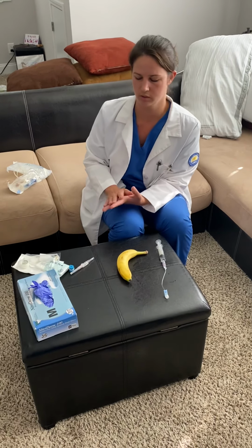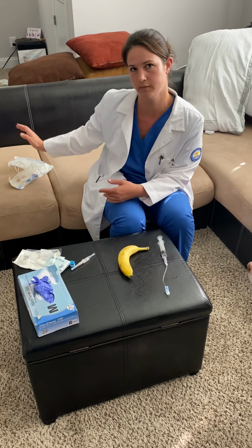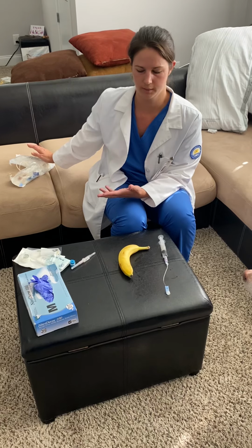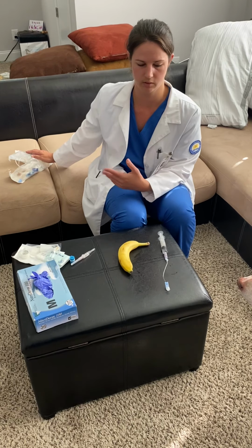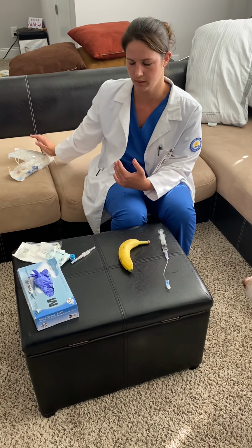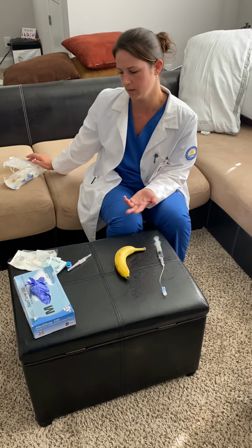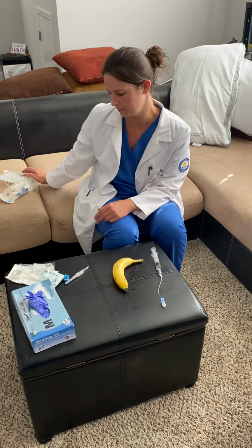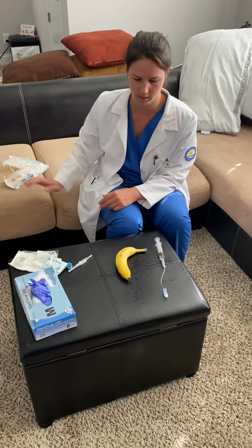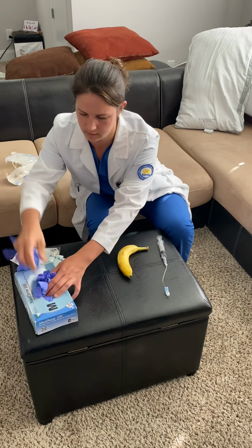And I have also, per the order, we're giving 150 mLs per hour of the normal saline. And so you want to go ahead before doing the IV insertion, make sure that you have your infusion rate, which when I calculated it, because we're doing over an 8-hour period, but it's 150 mLs per hour, that goes down to about 25 drips per minute. So that's all ready to go as well. I'm going to don my PPE, which is the gloves.